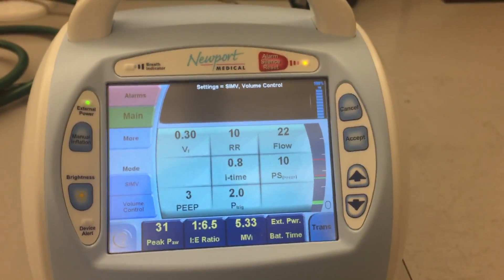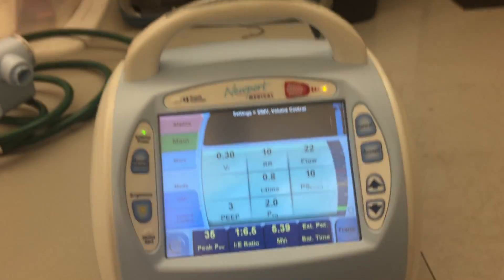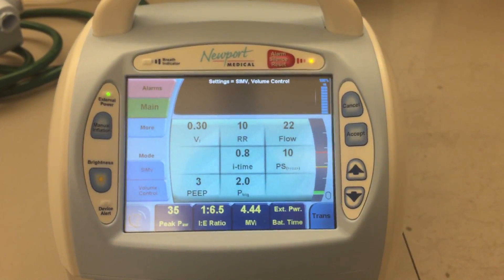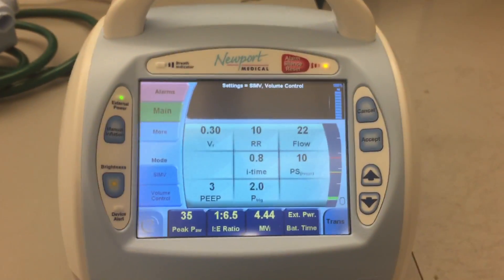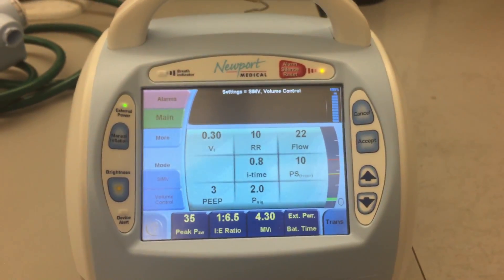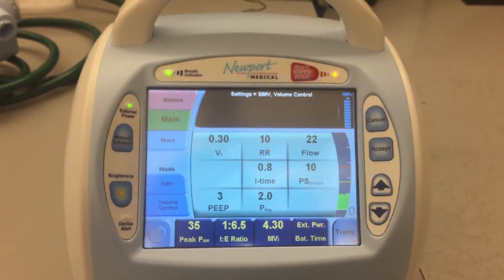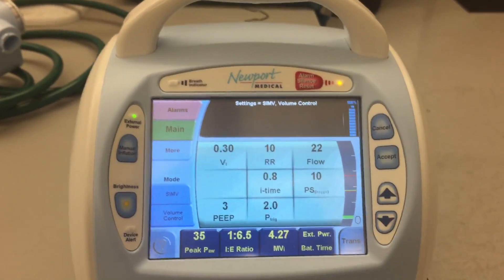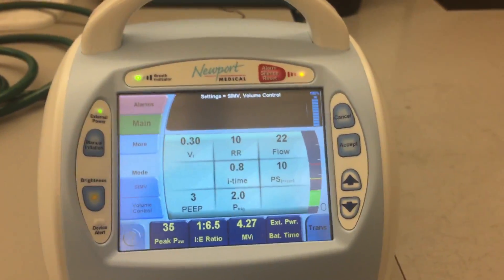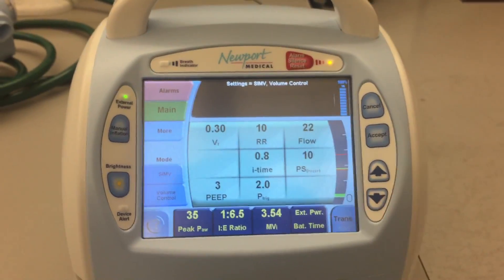And that is the basic setup of the Newport HT70 ventilator — a basic setup in volume control ventilation in SIMV mode. I'll be doing additional videos showcasing different options, such as using pressure control ventilation and even spontaneous modes, delivering CPAP and bi-level spontaneous ventilation. All right, guys — as always, thanks for hanging in there.